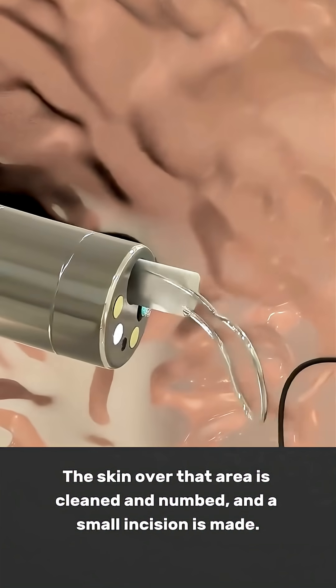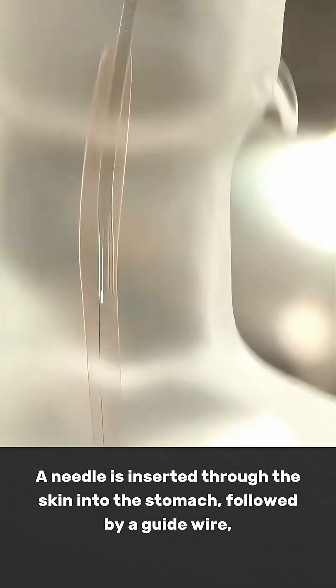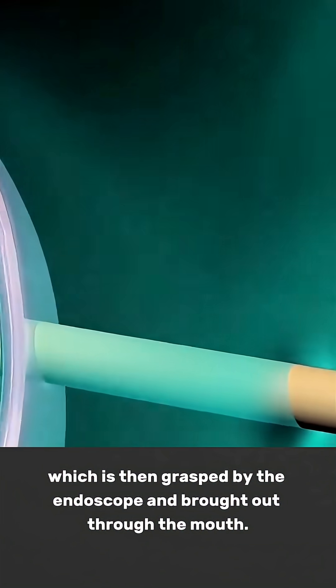The skin over that area is cleaned and numbed, and a small incision is made. A needle is inserted through the skin into the stomach, followed by a guide wire, which is then grasped by the endoscope and brought out through the mouth.